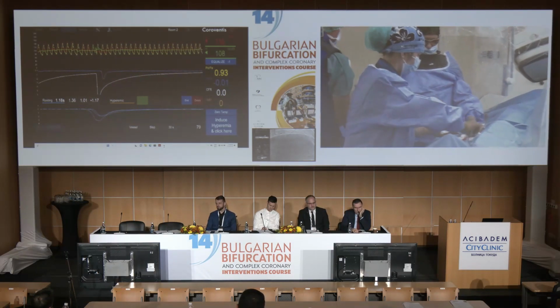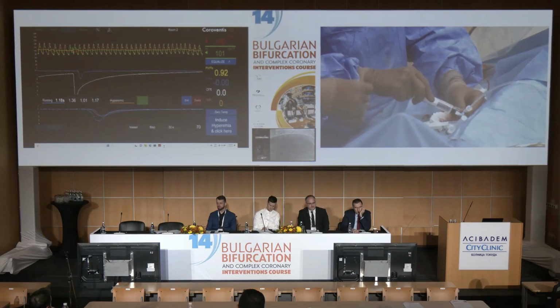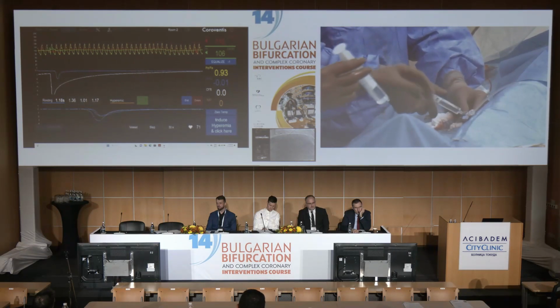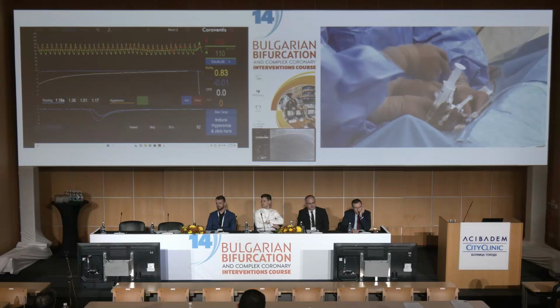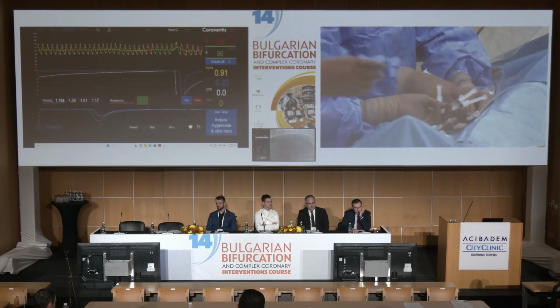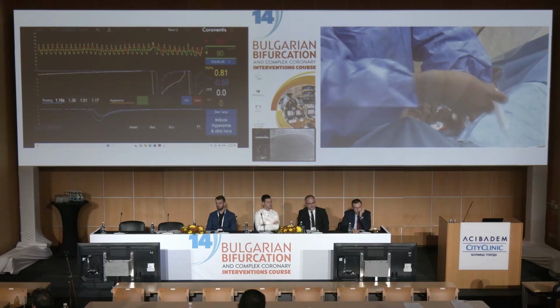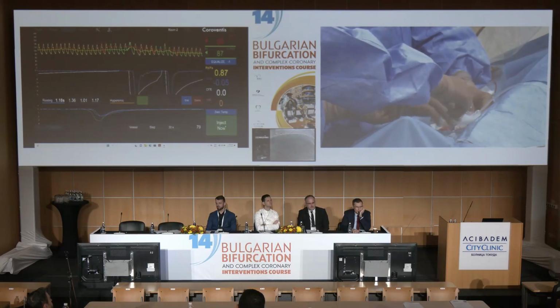This is what you are going to do. So when you have injected hyperemia, papaverine, you tell us. And this again can be done with adenosine IC. Okay, I'm ready. Okay, wait a minute. Okay, now I can click.